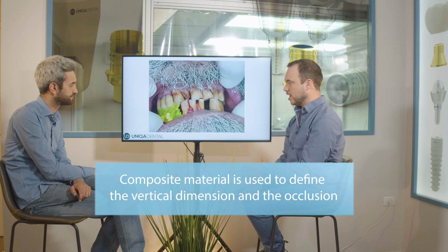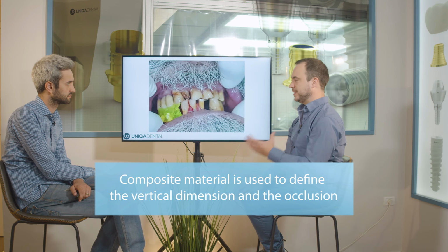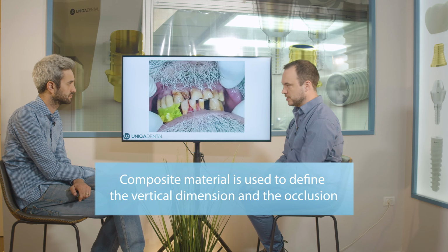We took the impression. We added composite material to know the vertical dimension, so our impression will keep the vertical dimension that the patient has. We don't want to change anything within the vertical dimension. We connected transfers to the left side also, added caps, and added composite material to maintain the vertical dimension. Now we'll take a pickup from both sides with putty material, and then we need to put analogs in this impression to make a model.